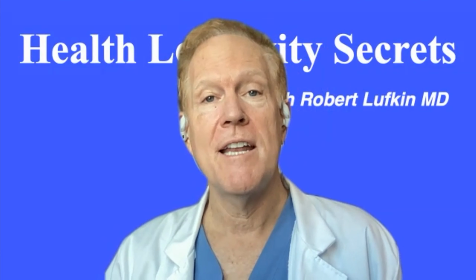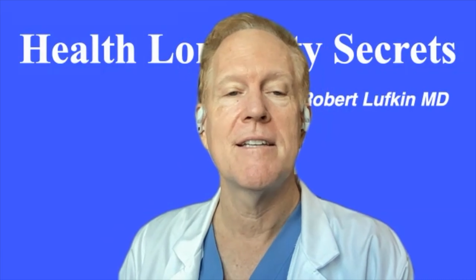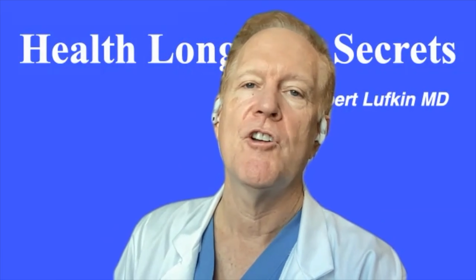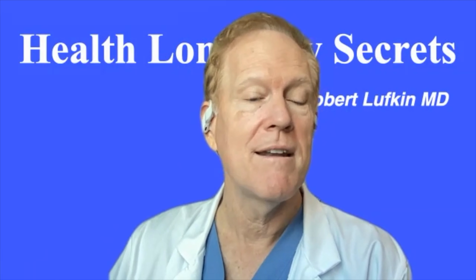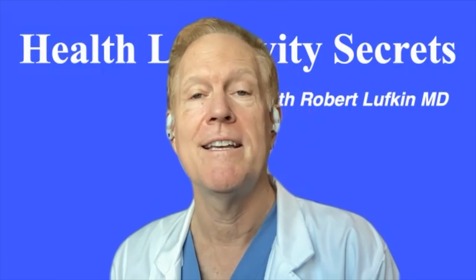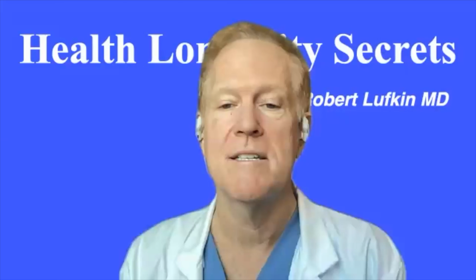And then by extending down to your thighs, you get large muscle masses, and presumably, what's happening in your thighs is happening in your calves. So it's not really necessary to do the calves, and the brain, like you say, doesn't add anything. So you're really hitting the high impact areas with this study.